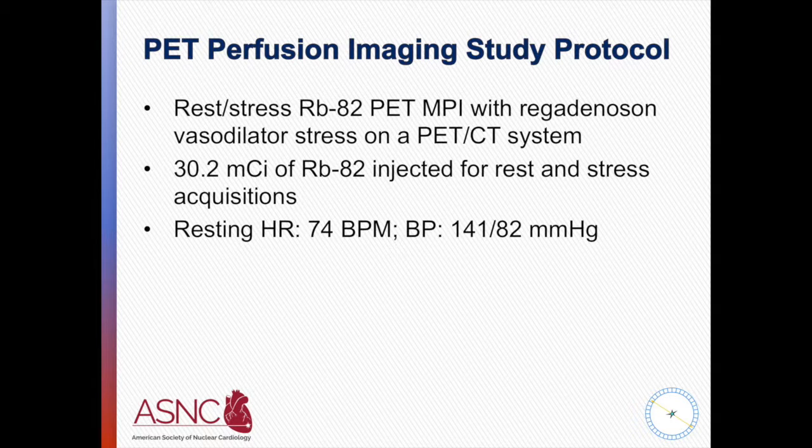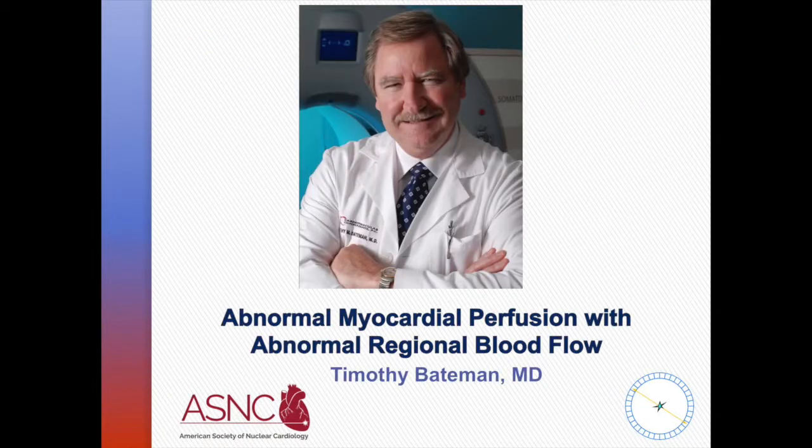As an inpatient, she continued to have negative cardiac biomarkers, and a myocardial perfusion imaging was ordered for purposes of further risk stratification and for diagnostic purposes. Now, interesting that this patient was on various medications, including verapamil, and I'm assuming that that's one reason why she was not stressed with a vasodilator agent directly from the emergency room. Do you want to comment on that?